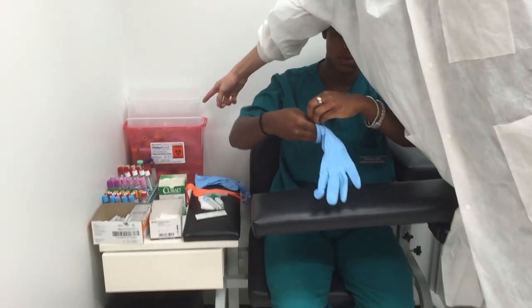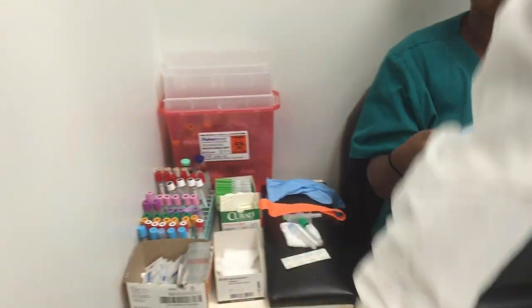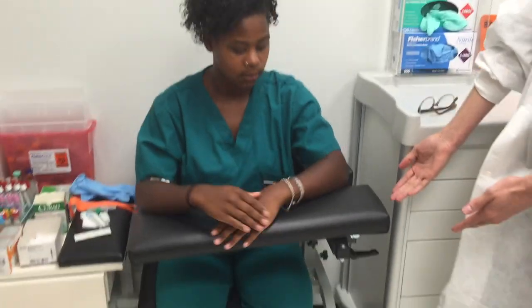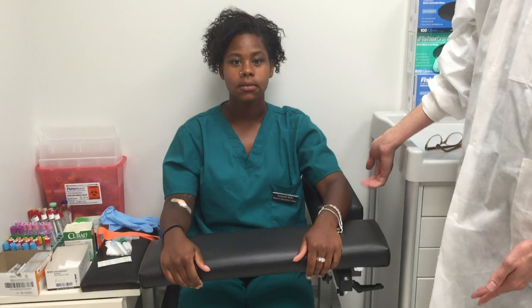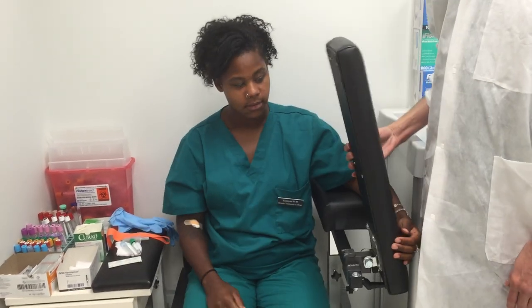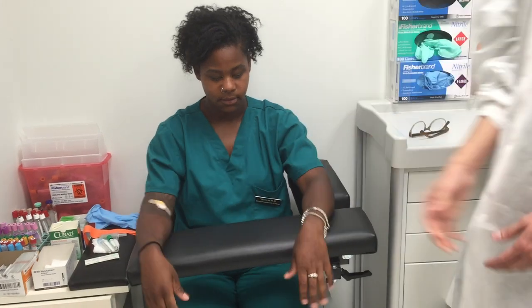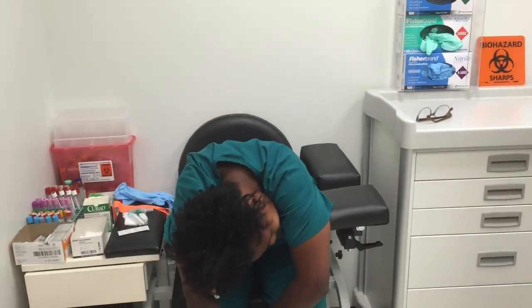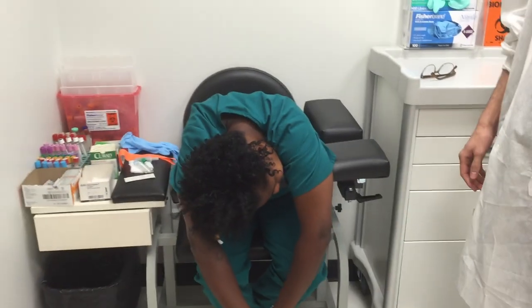Make sure that you have a biohazard sharps container and also a trash bin. Also, make sure that the patient has somewhere to sit or lay down in. In this case, we will be having an outpatient chair that has an armrest for the patient. This helps the patient relax their arm for the procedure and also will help the patient stop from falling in case of a sentinel event such as fainting.